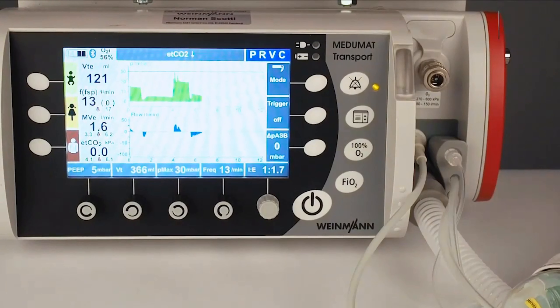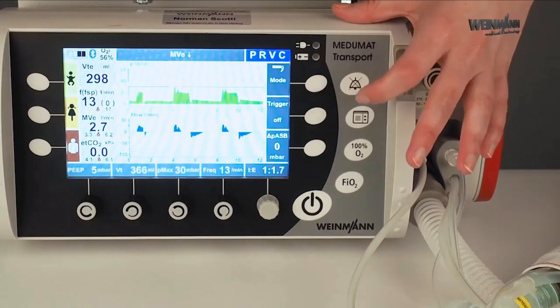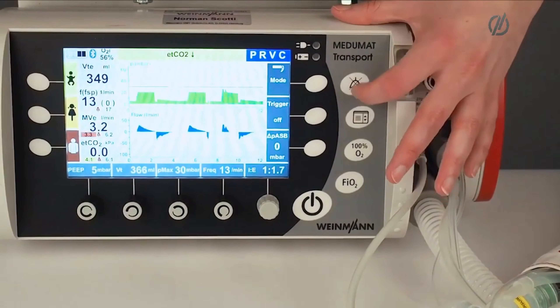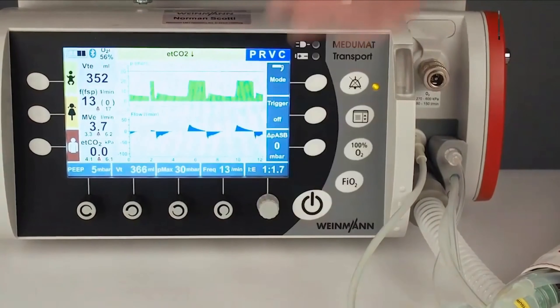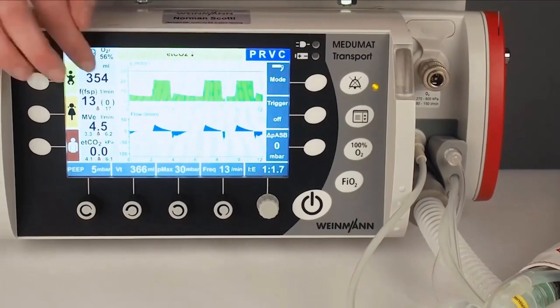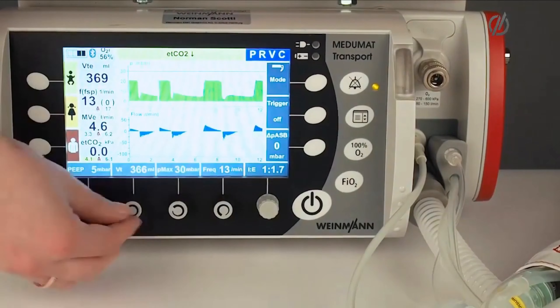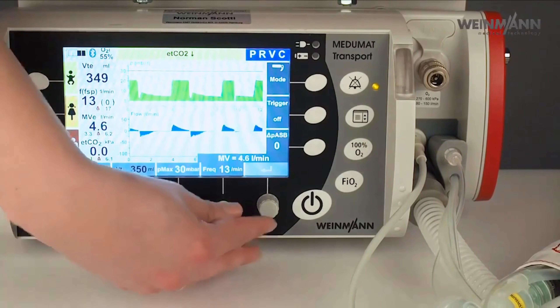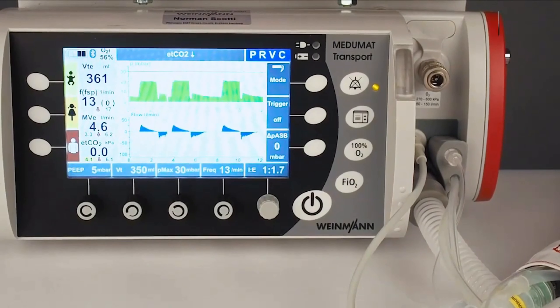Now the device starts ventilation. Here you can see the ventilation curves. In this pressure-regulated volume-controlled mode, the device needs two to three ventilations to find the right pressure. You can see it in the pressure curves, and below the pressure curve is the flow curve. On the right-hand side you have all the measurement values: tidal volume, expiratory tidal volume, ventilation frequency. Here you have the device settings — you can always change them, for example the tidal volume. Make sure to confirm every setting with the white knob, otherwise the device will not take the change.